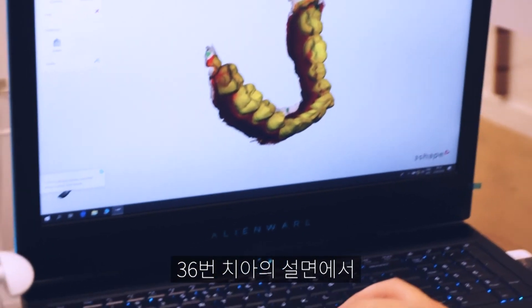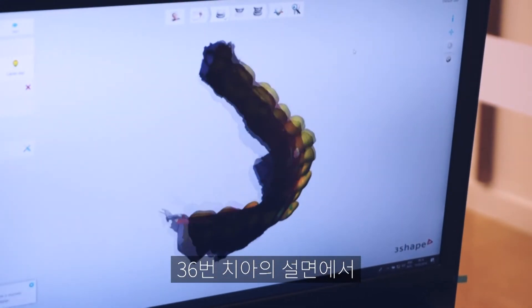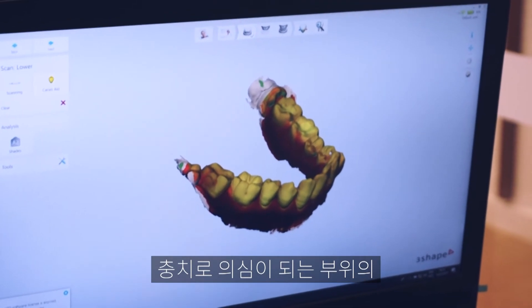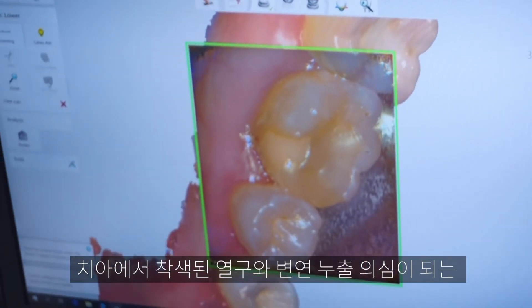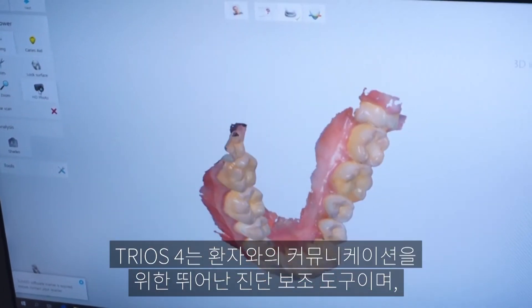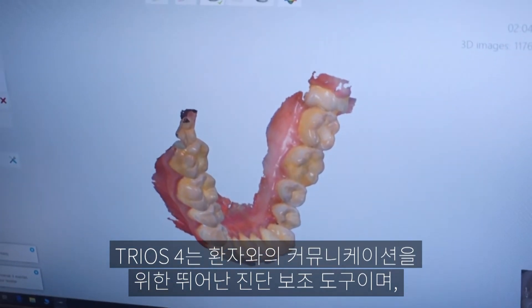You can just see on the lingual of that 36, so we're going to try and take an HD photo of that where potentially there may be some problems. You can see a large composite restoration with a stained fissure showing signs of early leakage.